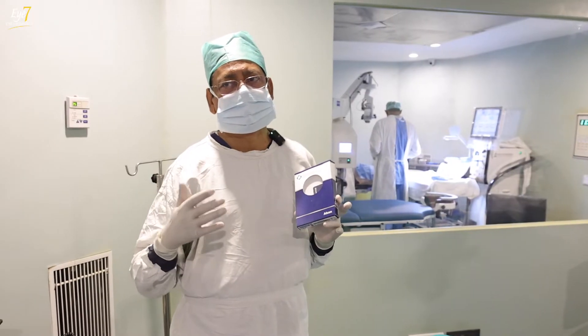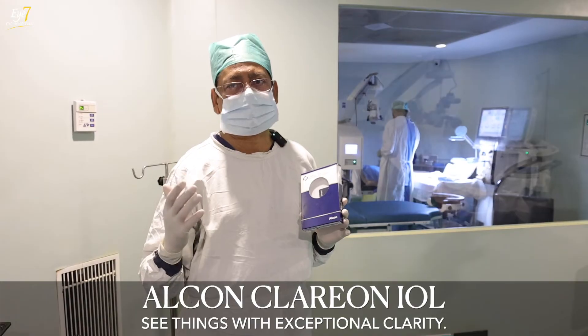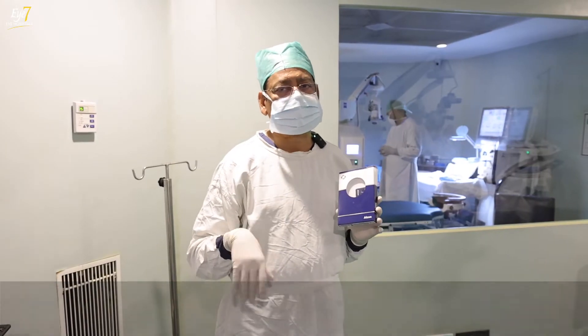That is why the Clarion version is the future platform, and slowly all the Alcon lenses — that means the Vivity and the PanOptix — will all come on the Clarion platform. That is the lens of the future.